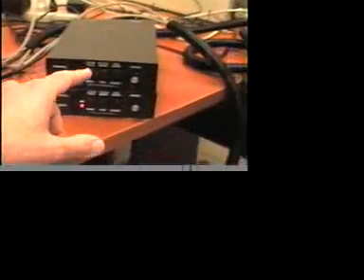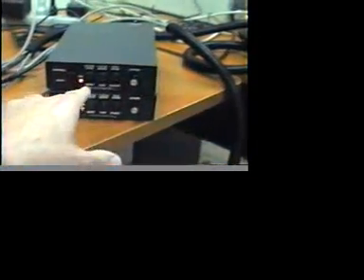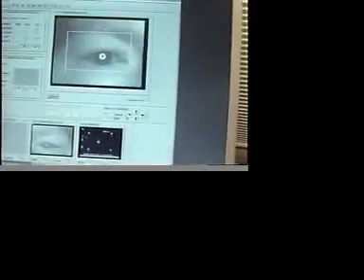To get his eye image in there, we've got the focus control. I'm going to pop him in auto mode. And I have the focus, zoom, and iris controls here for each eye. I've got a nice zoom in on that, a nice left eye. I've got the pupil and the corner reflection nicely being tracked.